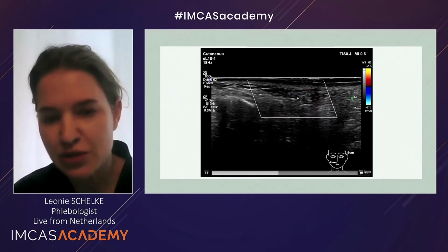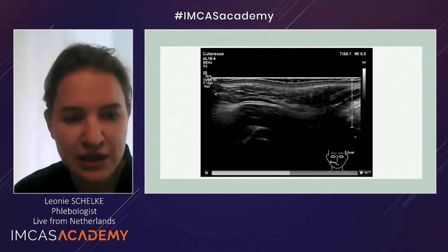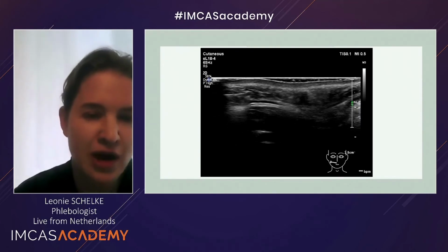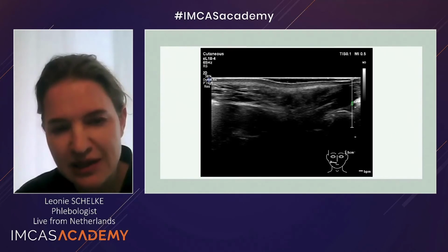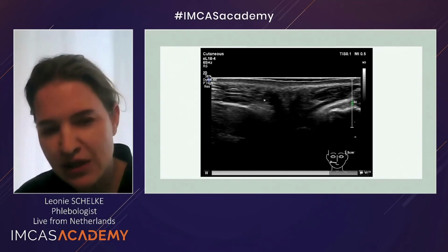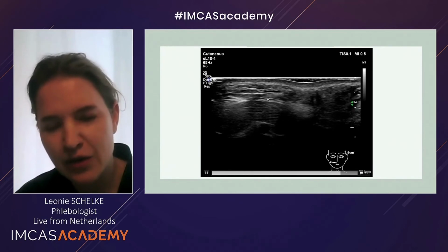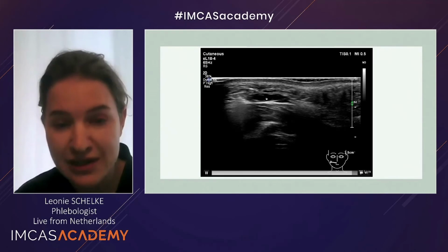So here is my cannula, and it's a little bit too deep. So I retract it, and now I am very superficial. Can you see that? This is injected superficially, almost to the dermis. And in comparison, I will inject here in a deeper layer a hyaluronic acid product that is meant to be placed deeper. So here's the superficial one, and here is the deep injection.